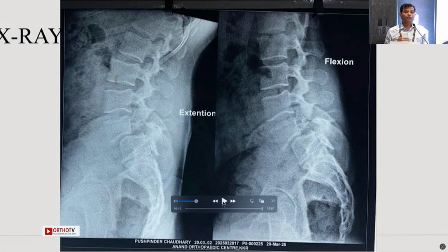For the patient, because the O-arm is a very low dose radiation, it's lesser than C-arm actually. When you take multiple shots for putting these percutaneous pedicle screws, one O-arm spin is lesser than those shots. So one is radiation.